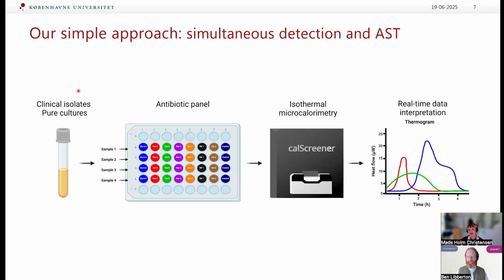If they are slow growing or more metabolically inactive, you would still get a signal, but I would have to adjust the thresholds for those cases as well, because they might not reach the threshold. And from what I have seen, the shape of the heat flow curve is not as distinguishable as when it has this whole peak structure. It more flattens out across time. So it's more of a consistent heat output over time instead of this peak signature that we see.